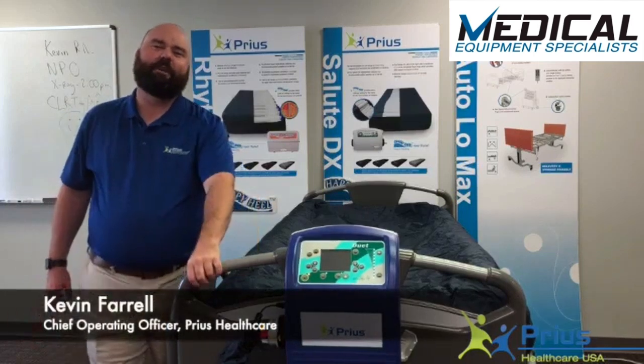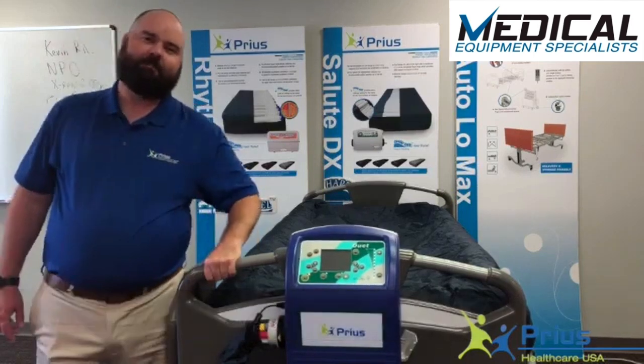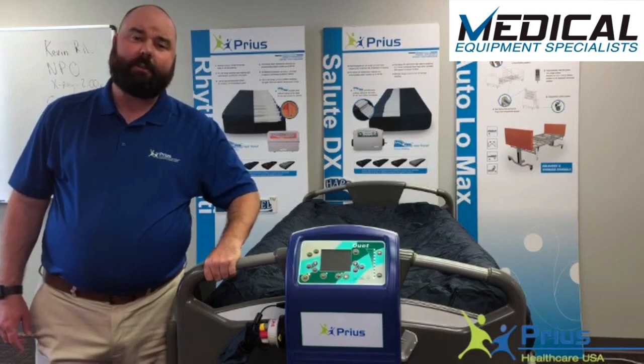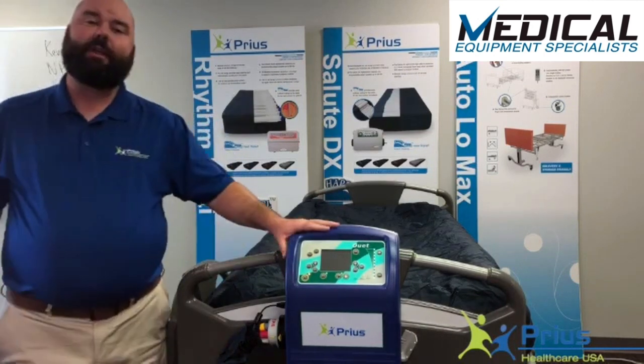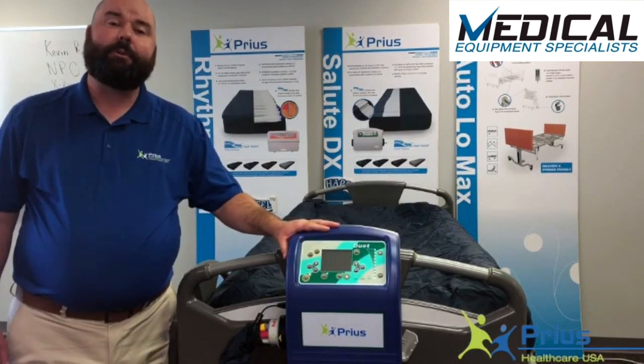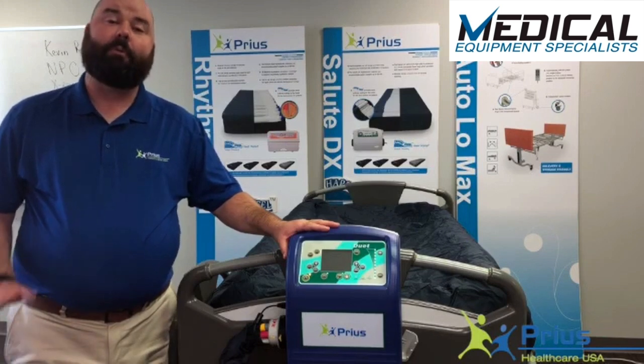Hi, I'm Kevin Farrell from Prius Healthcare and Moxie Enterprises. Today we're going to go through with you our Duet Complete Mattress System. The Duet combines three therapies: true low air loss, alternating pressure, and continuous lateral rotation, and can perform all three of those therapies at the same time.